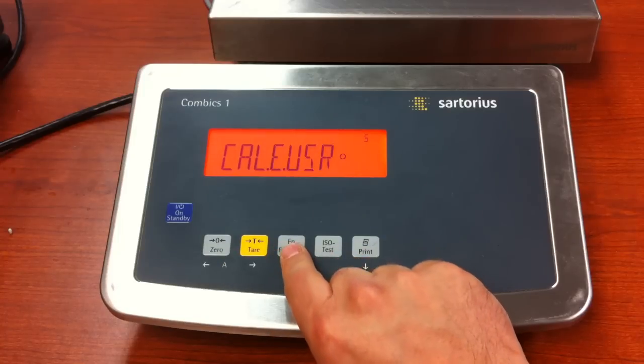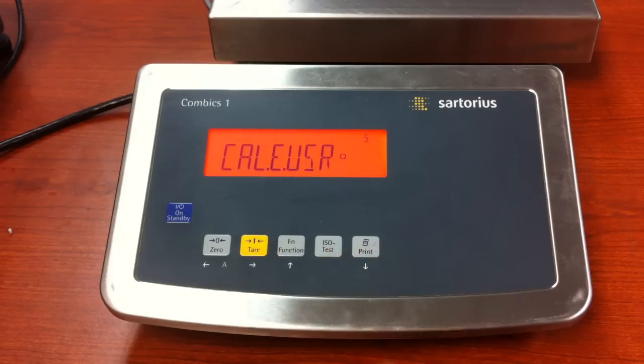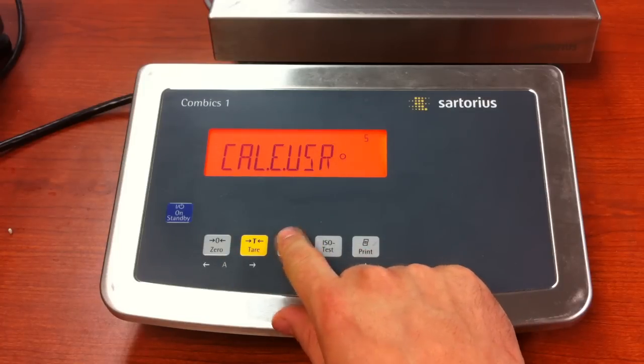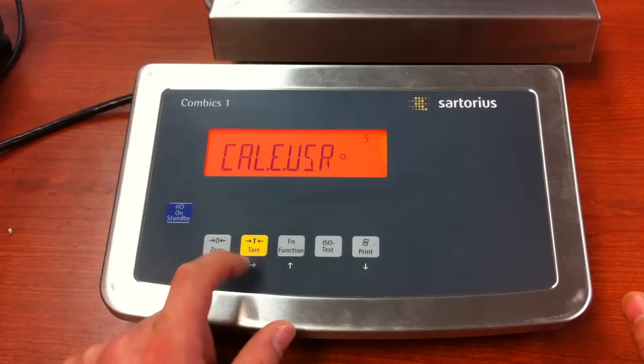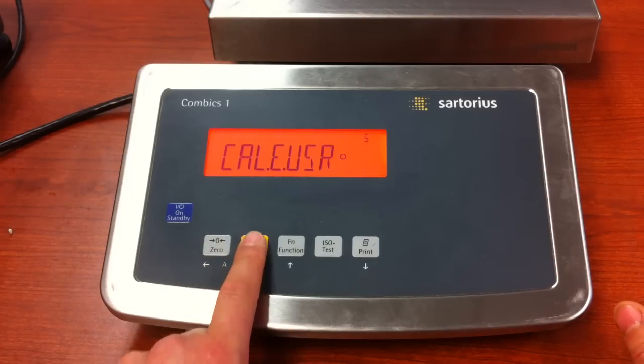Cal adjust. Press and release the tear key. This one is setup for calibration by user. If you have a brand new unit, it may be setup for cal.ext, and that would have a predefined calibration value. The great thing about doing it this way is that you can select the weight that you want to use, or the weights that you have, as long as you have at least 20% of the capacity.